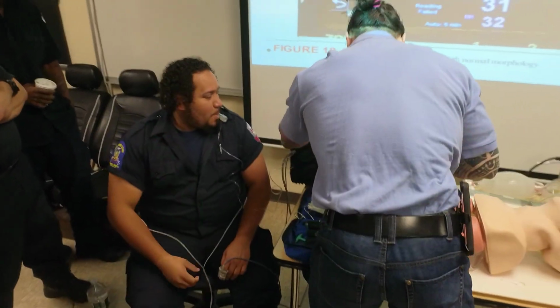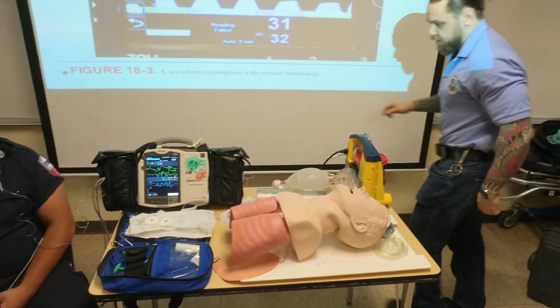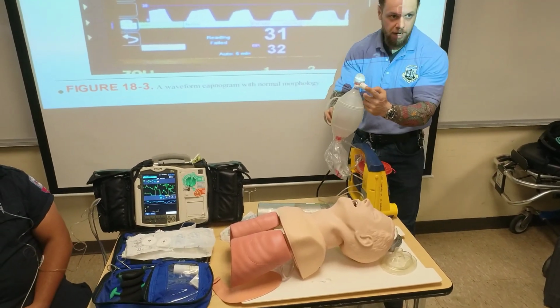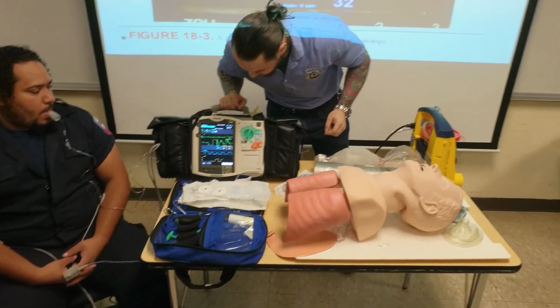Now try to breathe calmly, right? So that we see. So what he has, right? He has the end-tidal CO2, but really what I'm going to do is put it here in my mask. So you guys see the monitor, and you know what you're seeing, right?